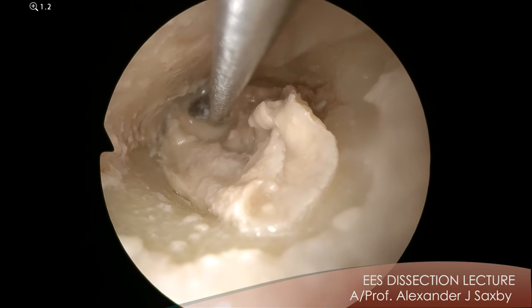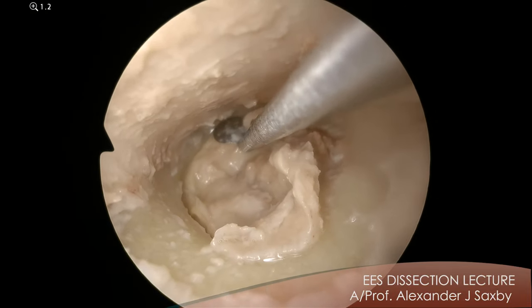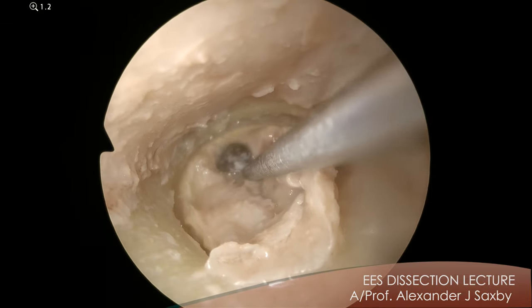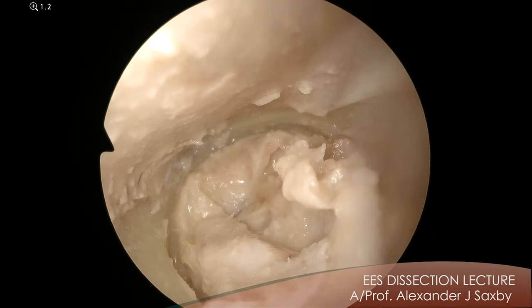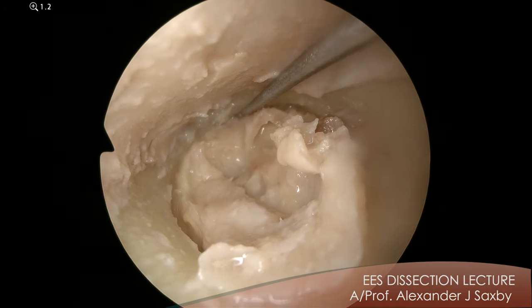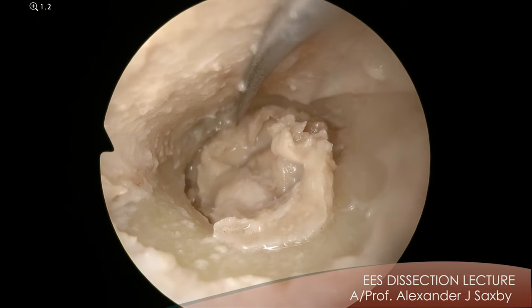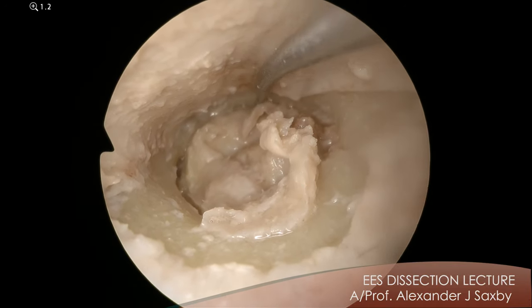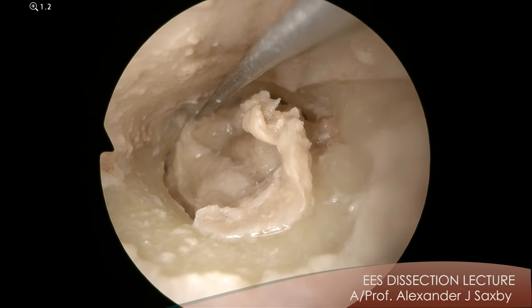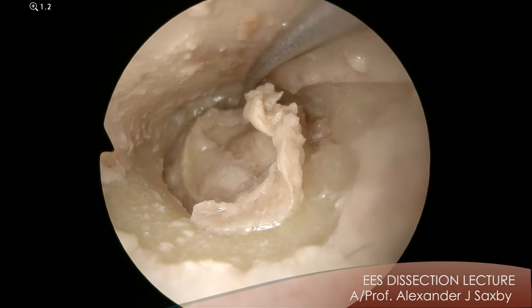So when you've got the drum down you should see the annulus. Can everyone see the annulus there? And then you'll need to make an incision with a rose needle into the mucosa. So mucosa is here and we just incise it with the rose needle into the middle ear. This is not a thing you'll do in real life — this is for the anatomy.